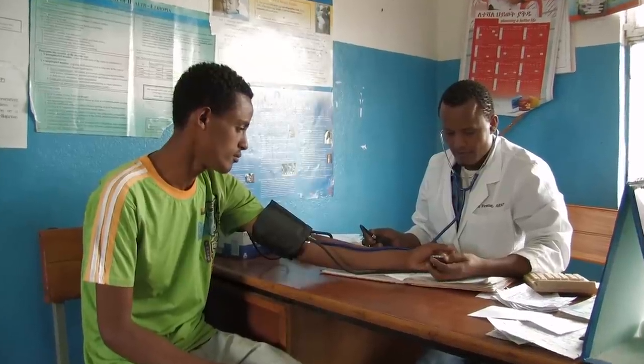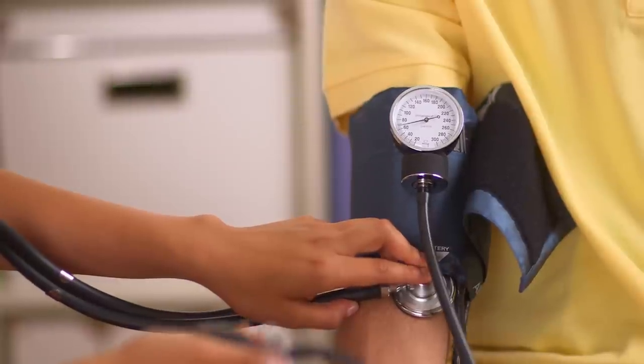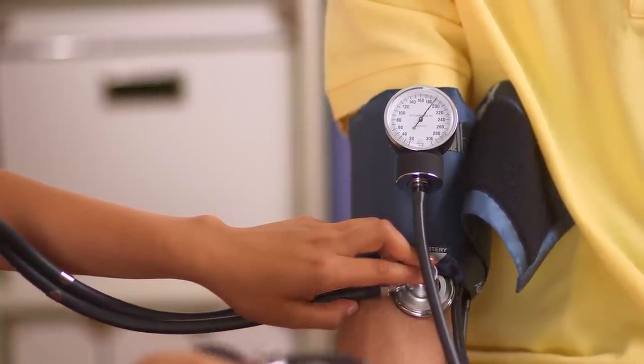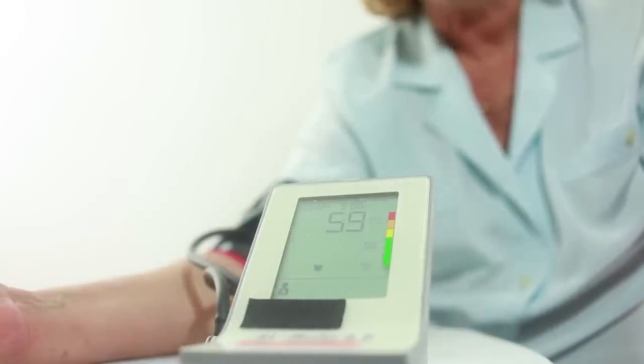You probably have gone to a pharmacy or doctor's office and slipped your arm into a device like this. As the cuff squeezes and then gradually deflates, it varies the external pressure on an artery in your arm. A sensor inside the cuff measures blood volume in the artery, and the device uses this data to calculate your blood pressure.